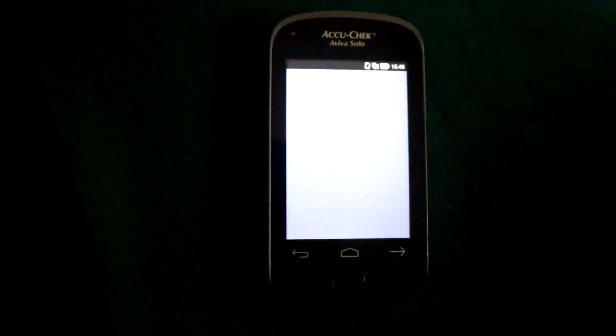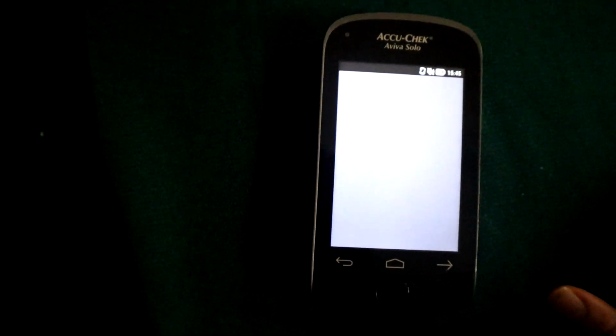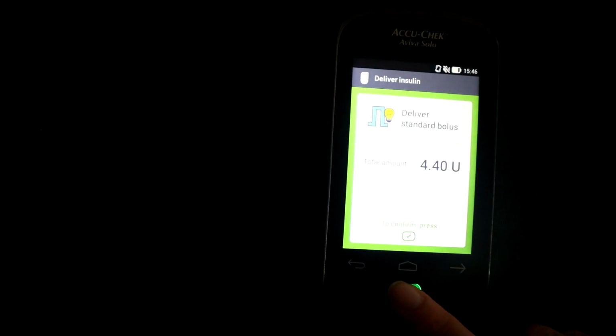So this is not going to suggest as much correction as it wants, because it thinks I've got insulin on board, obviously from previous doses, but clearly those doses have not been going in. So it's saying minus 1.6, so I'm going to add 1.6 onto this and then some more because of ketones. So yeah, this will do. And I'm going to try and not cry.